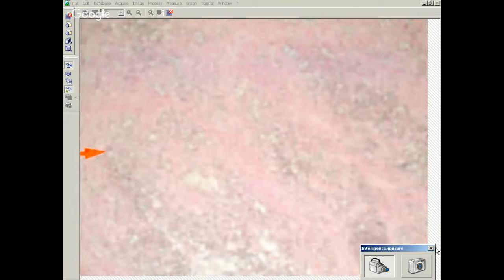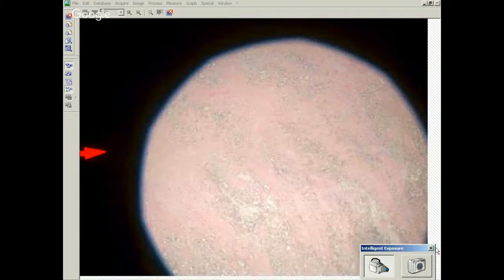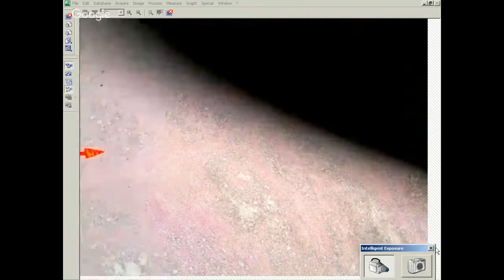And the other fungus that likes the appendix is mucor, which would look very different, right? Mucor would look very different from this.